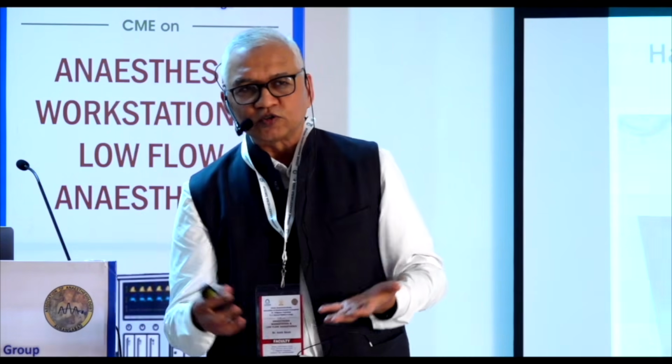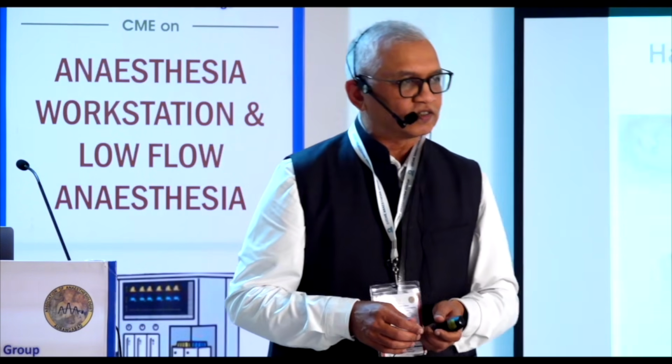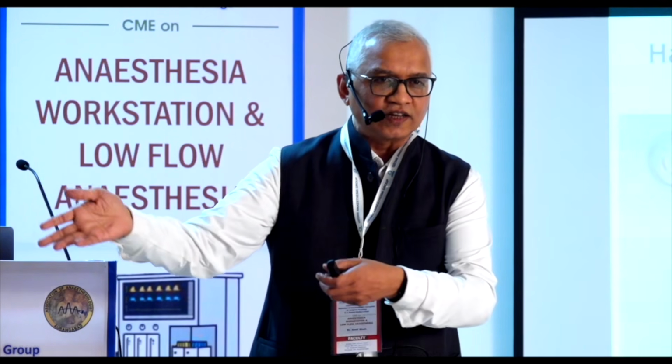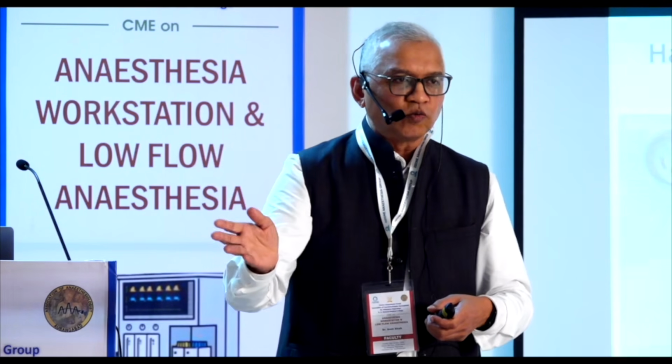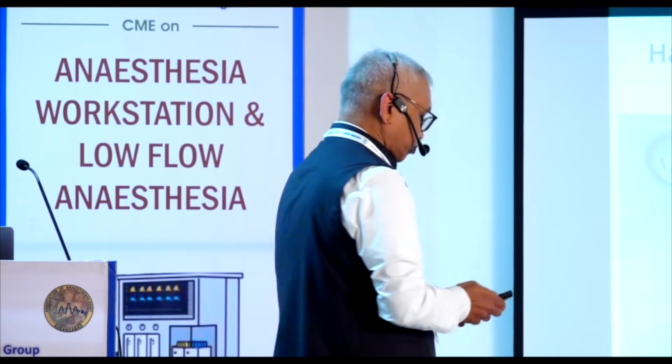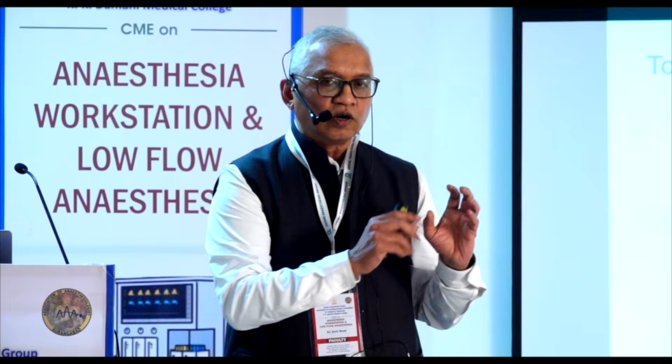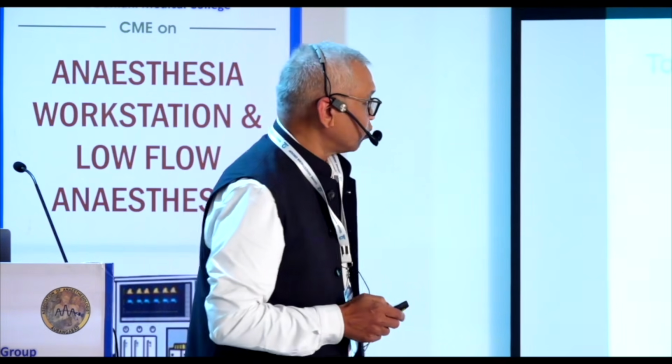Now imagine this situation in a pediatric patient. At the end of anesthesia, you increase the flow to flush out the anesthetic agent, and then the tidal volume jumps in a pediatric patient. Now, why is this happening? Okay. To understand why this is happening, and what technology or system inside different anesthesia machines is there to prevent this, is what we are going to learn next.